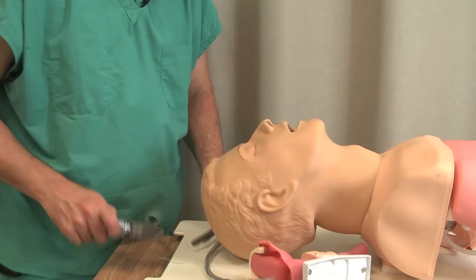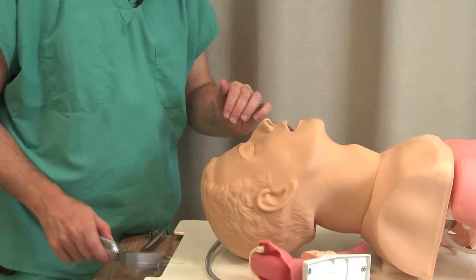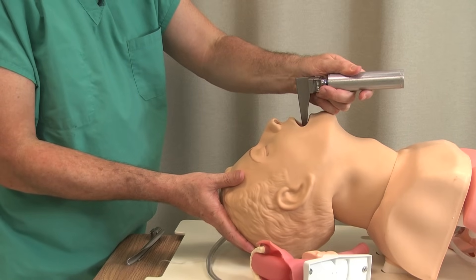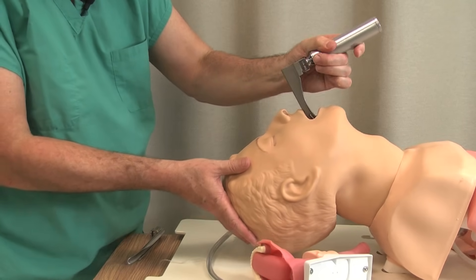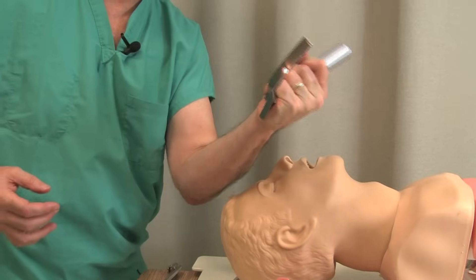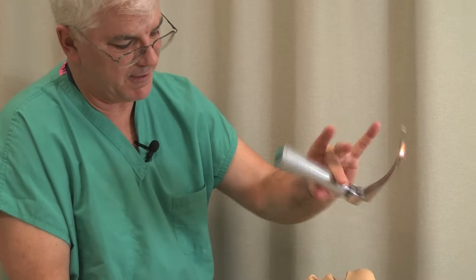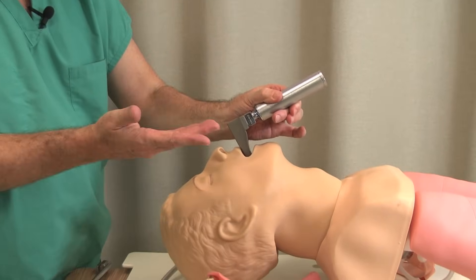If you've really exhausted your efforts, go to something else — go to an LMA or go to a fiber optic. To review: good head position, way to the right, lift — the epiglottis comes down, lift again, and put the tube in. Notice this isn't a muscle affair, this is not a strongman contest. The idea is to do this with technique. You can do this with just your thumb and your finger — if you get it to the right and just lift a little, that really helps.